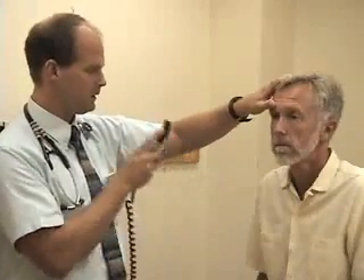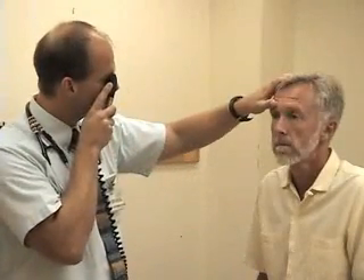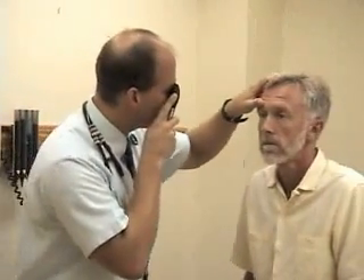I'll get back here and check for his red reflex and then gradually come in. If I'm about 15 degrees from the midline, I should come in right on his optic disc. Then I'm going to trace the vessels back towards the disc and trace them out in all four quadrants.